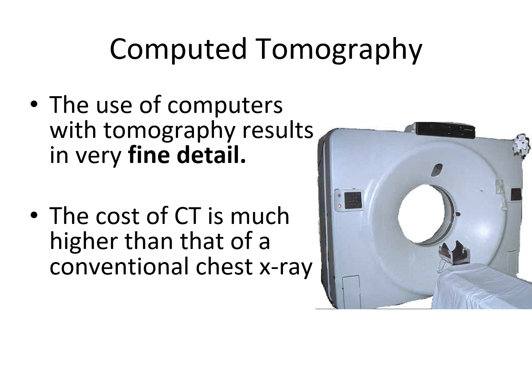It can help detect and differentiate lung tumors, lymph nodes as small as 2 to 3 millimeters. They also use it to look at chronic interstitial lung disease, and for early detection of pneumonia, abscesses, cavities.